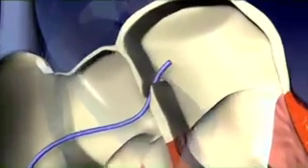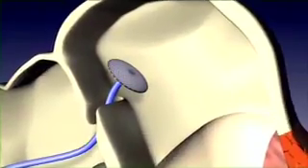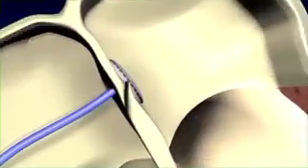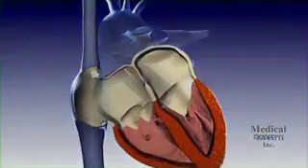So again, this is showing the catheter going across the PFO, and here's the release of the left atrial disc. And as you saw, Dr. Quesada does, you pull it against the interatrial septum, like that. And then we saw the second disc, the right atrial disc, deployed. And right now, what Dr. Quesada is going to do is unscrew that device and release it so that it's closing the PFO.